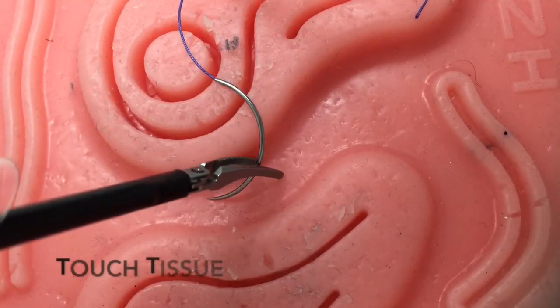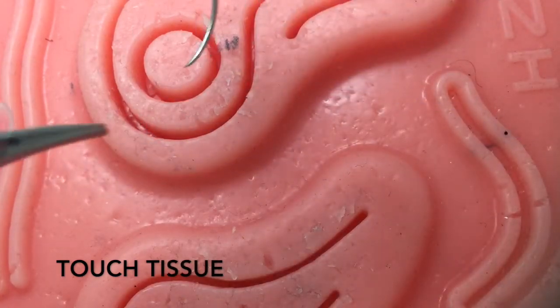Touching tissue will help you overcome the two-dimensional display in a three-dimensional environment.